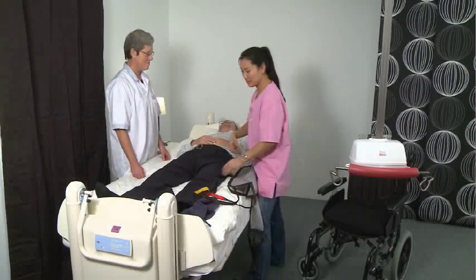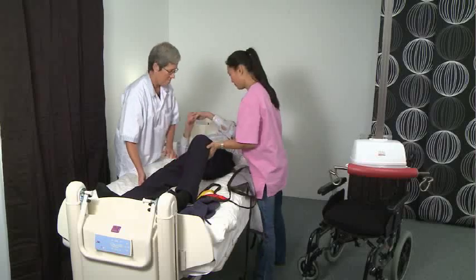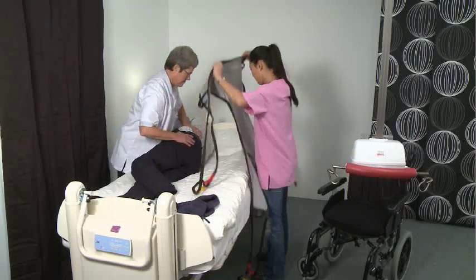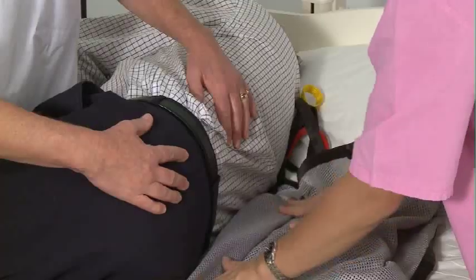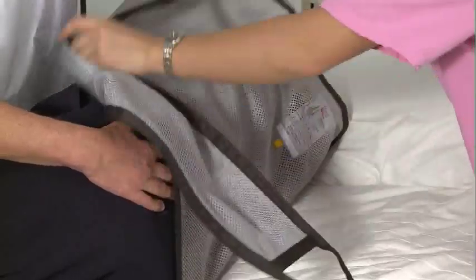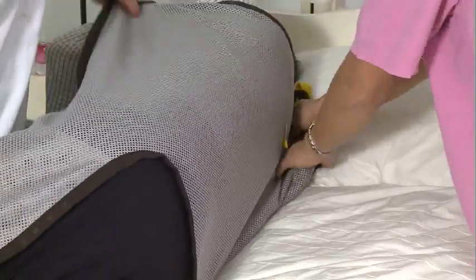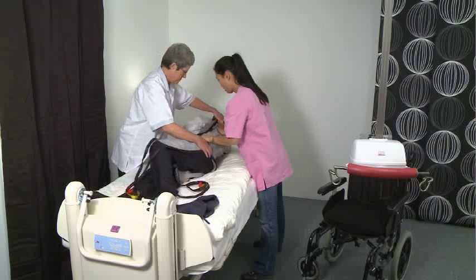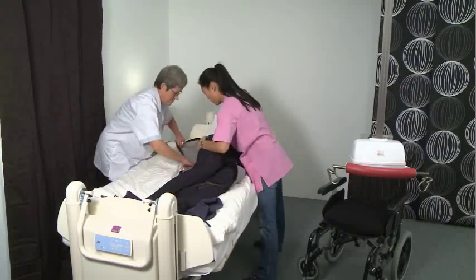There are alternative methods to place a harness around a reclining patient. Here the client is helped onto their side. The harness is positioned so that its center is along the client's spine and the bottom of the harness is in line with the coccyx. The harness from Human Care is available in net or Trovira material. Roll the client back so that the harness can be drawn out onto the other side. Ensure that the harness is evenly positioned.